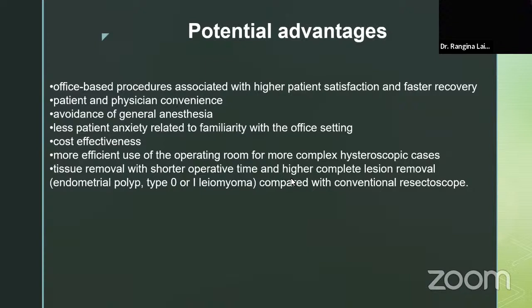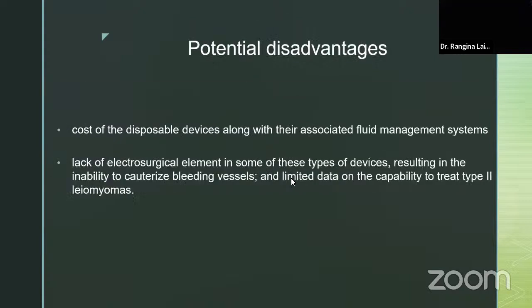Yes, in my practice, we are doing endometrial polyp removal, hysteroscopic myomectomy, uterine septum resection, and complete uterine septum resection. Yes, and of course, as I have mentioned, second trimester abortions. I have done almost 13 cases of fetal bone removal.